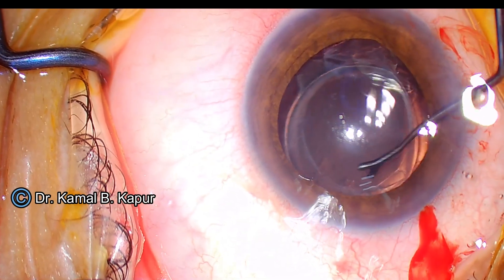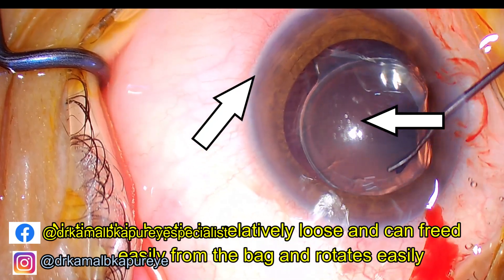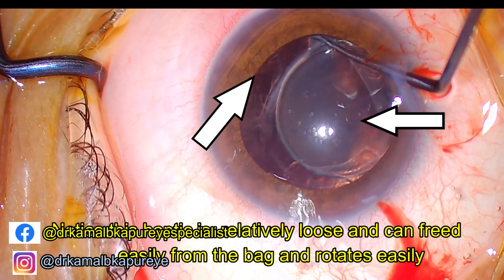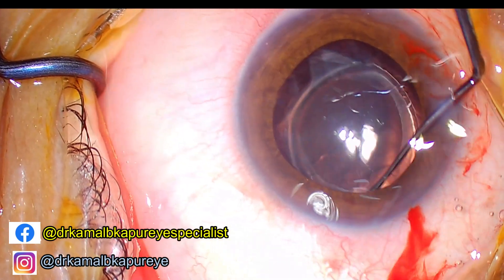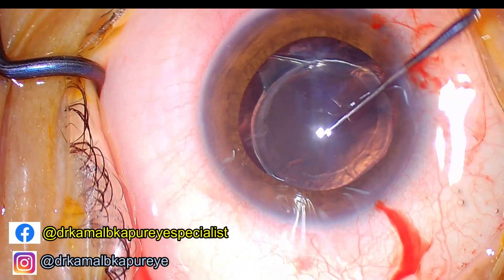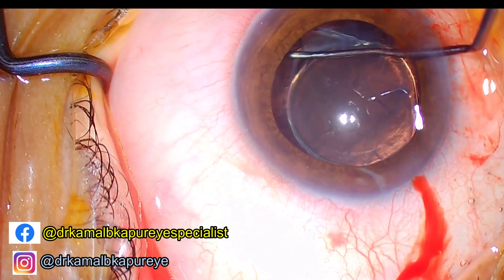Since the cataract surgery was done around six weeks ago as told by the patient, once I have been able to separate that area, the second step is to break the adhesions between the haptic and the capsule. This is usually the most tricky part — the haptic sometimes could be caught in the periphery.